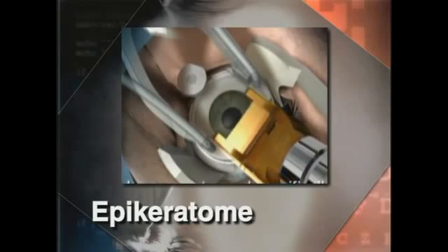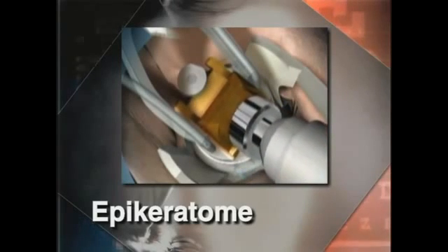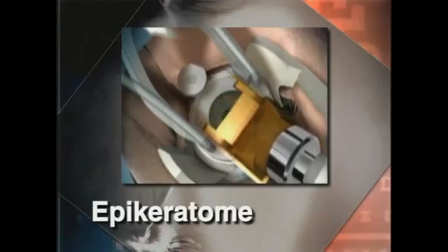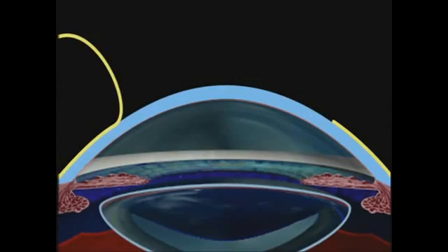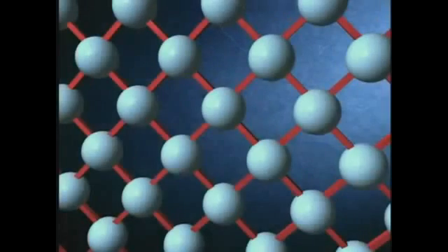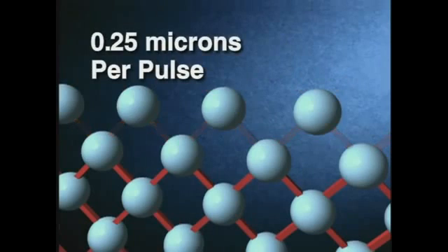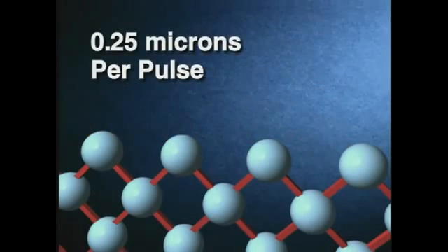EpiLASIK is different from other forms of advanced surface treatment in that it actually uses a special instrument called an epikeratome to make a hinged epithelial flap. You will be asked to look at a fixating light as the laser reshapes your cornea, often within a minute or so. Advanced surface treatment uses ultraviolet light from an excimer laser to remove tiny amounts of tissue from the cornea with accuracy up to 0.25 microns with each pulse.